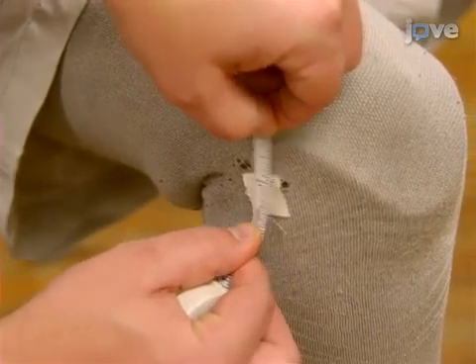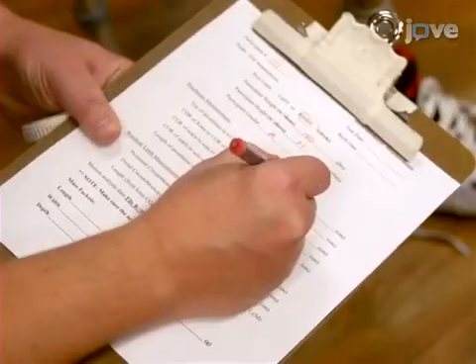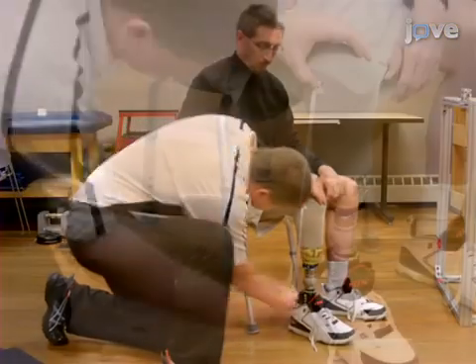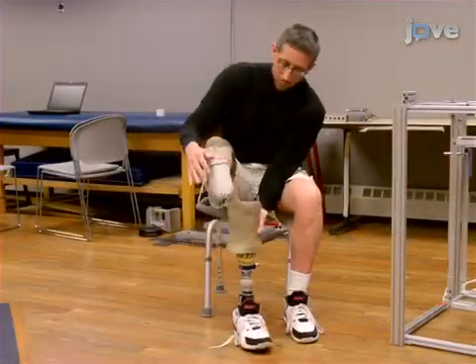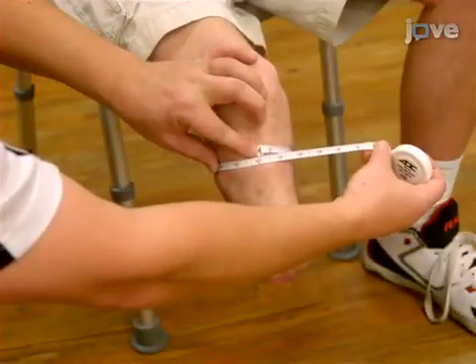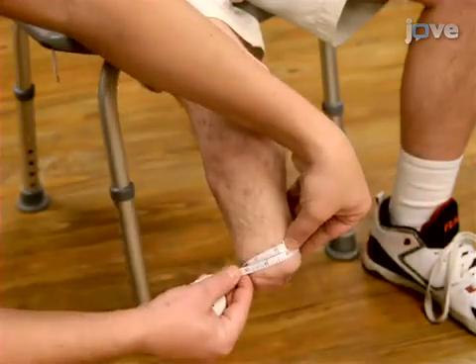If the knee COR sits inferior to the lip of the prosthesis, this value should be recorded as a negative value. Next, determine the distance between the knee COR and the ankle COR. Then, remove the prosthesis and the underlying sleeve to take measurements of the residual limb using a flexible tape measure to estimate the inertial properties of the residual limb.